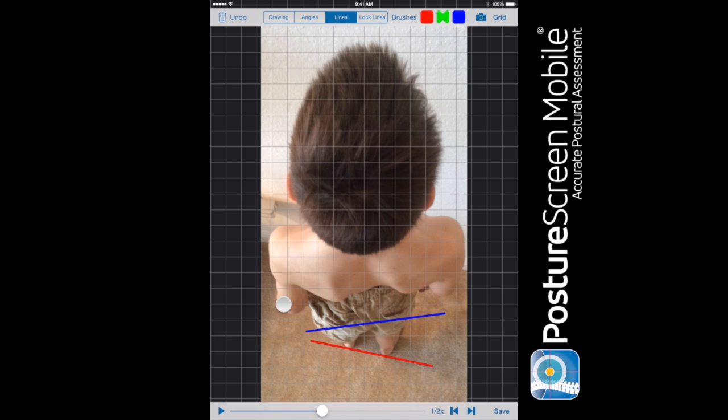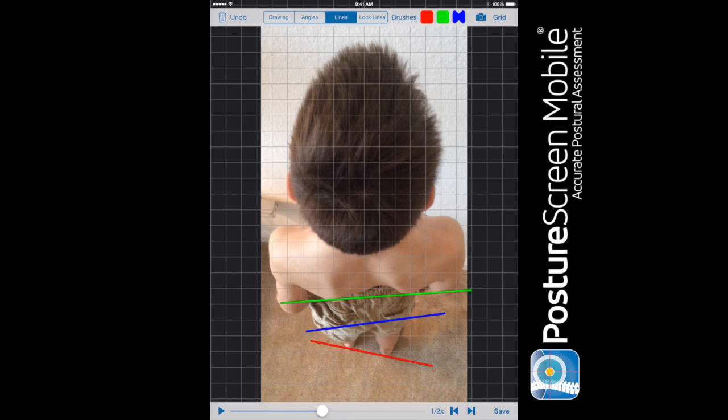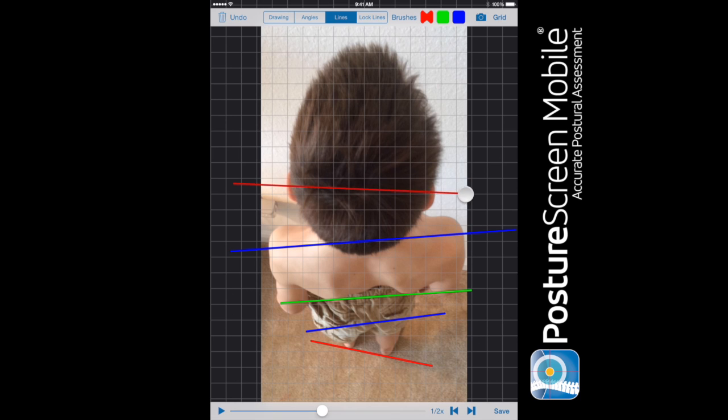And then let's change the color. We're going to go ahead and do posterior of the scap, and then let's go ahead and change it. We're going to go through the shoulder joints, the AC.